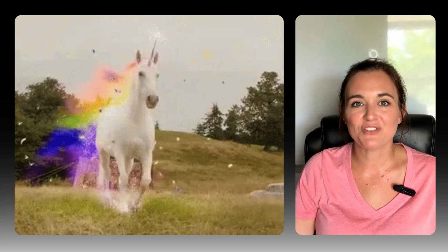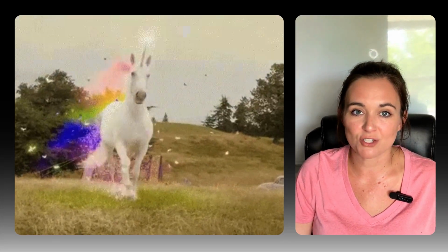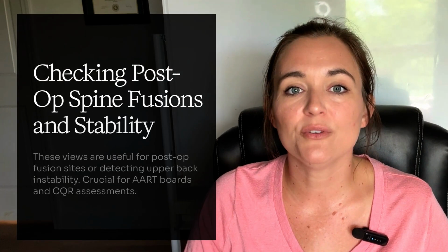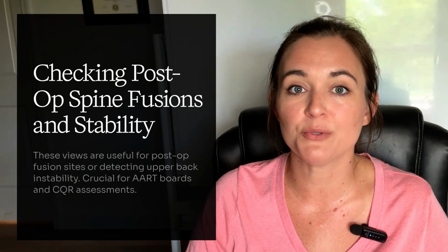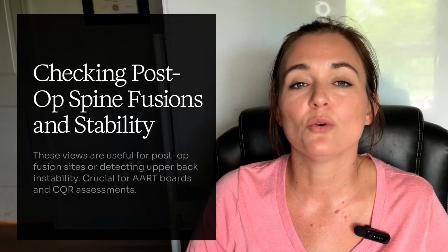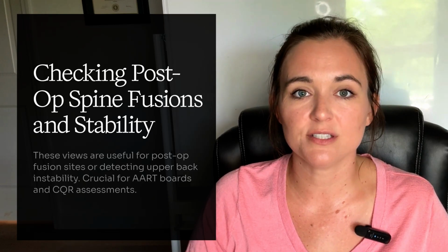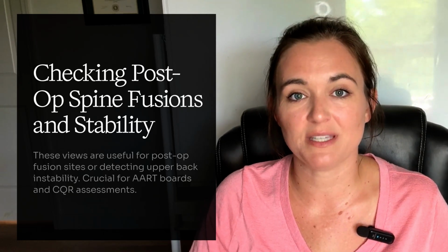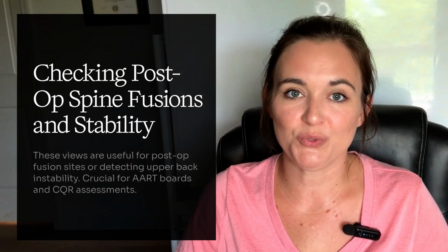All right, this next set of views is kind of like a unicorn in clinical practice, not because they're magical, but because they're rare. Let's talk about thoracic spine flexion and extension views. Now, I know these aren't something you're doing every day. If a spine surgeon wants to check a post-op fusion site, or if there's a concern about upper back stiffness or instability, these can be ordered. They're also fair game on your ARRT boards or CQR assessment. So let's break down how they work, and when and why you'd use these.